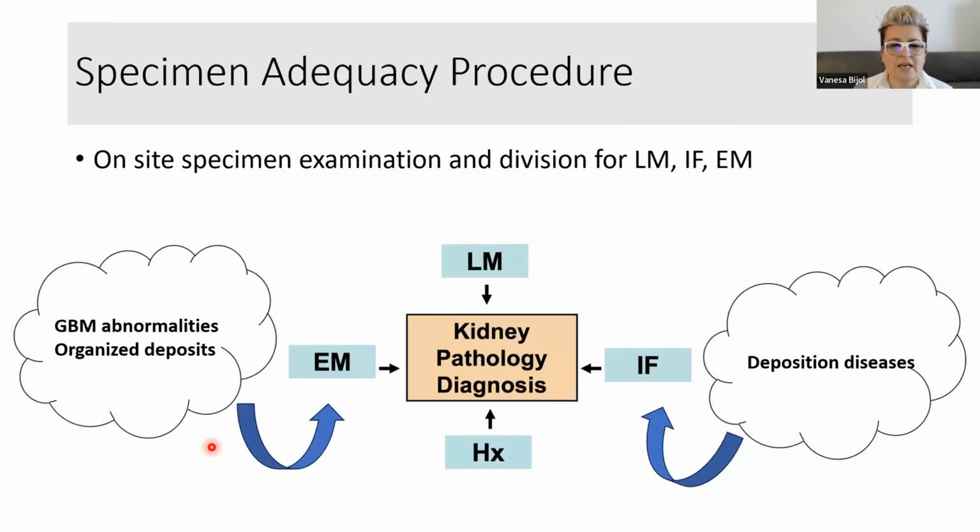And I always get questions from people from parts of the world where electron microscopy is not easily done, how to actually live without it, or how to cut the corners in various ways. And I think that's really a disservice to patient care at the end of the day, because you really have to have these things. And sometimes it feels like overkill, but very often you are grateful that you have all these studies when you can perform them.